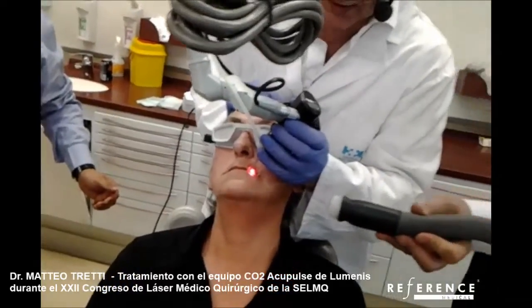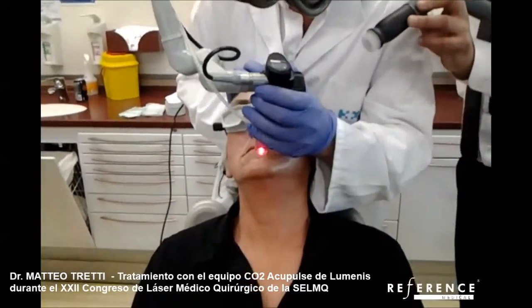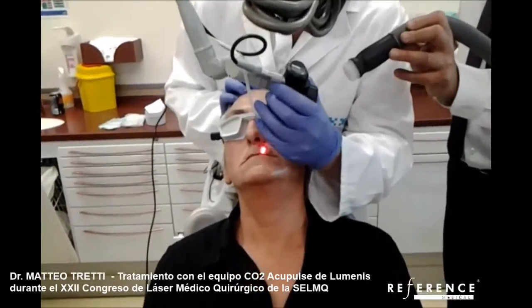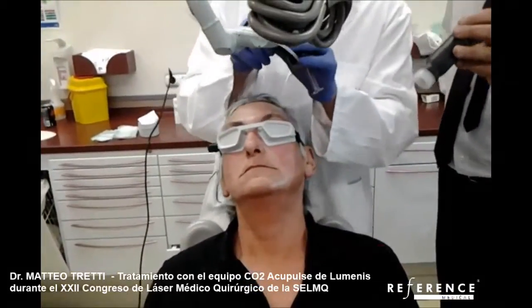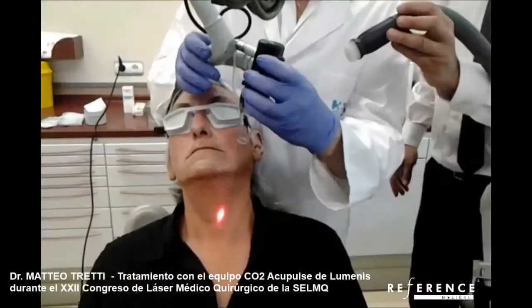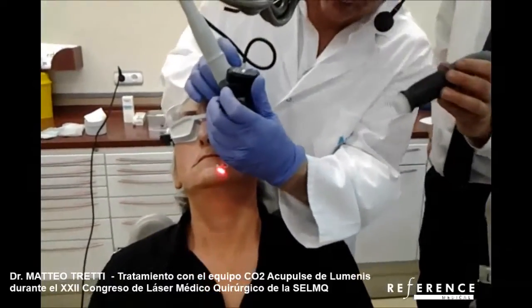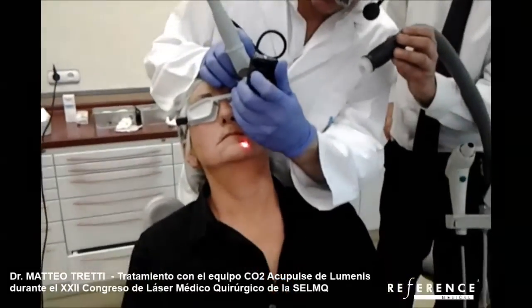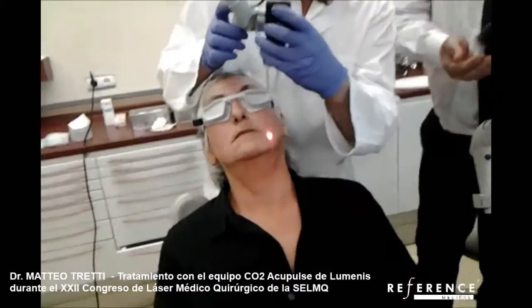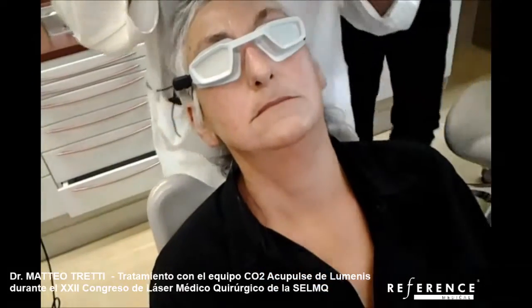Here it is absolutely clear that we have very small ablation. The idea of this first step is to have great collagen production exactly where we need. I'm using 20 mJ for each micro shot and a density of 5%. I do not need to ablate skin — the idea is to stimulate new collagen production exactly where we need.